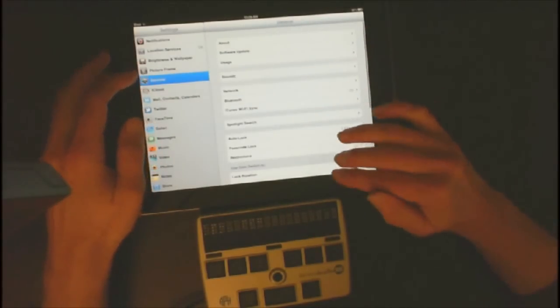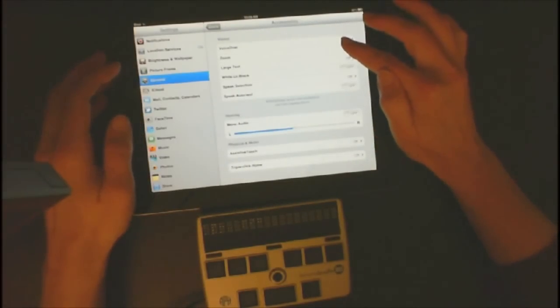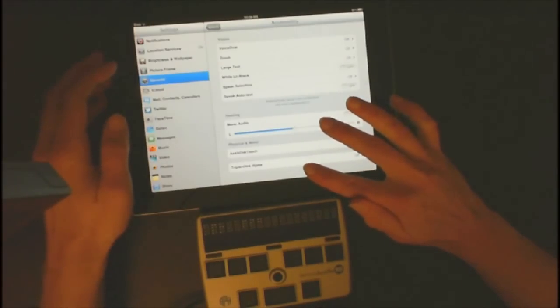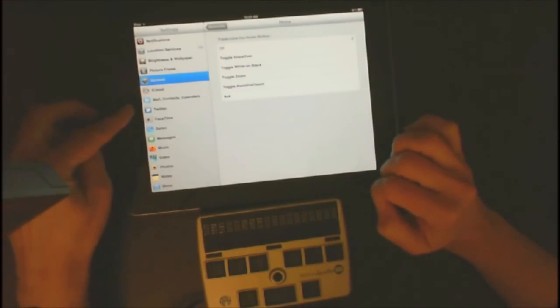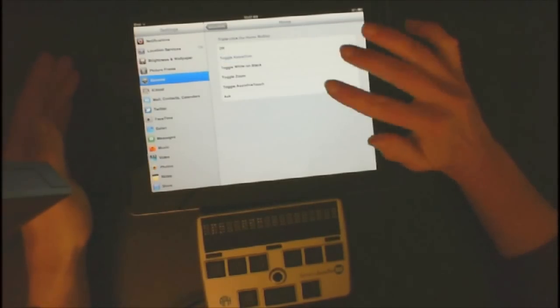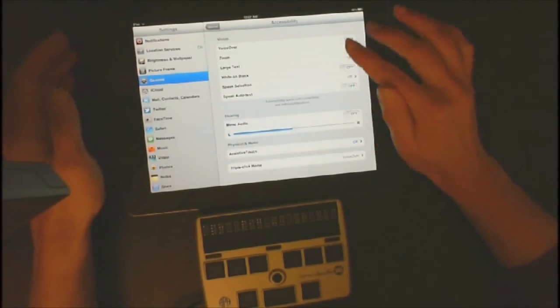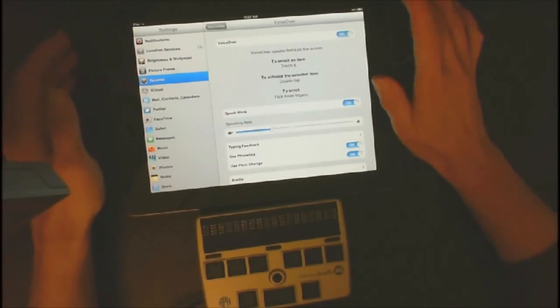I want to go ahead and go back to General and go down to Accessibility. I'm going to open Accessibility. Before I turn on VoiceOver, I'm going to go all the way down to the bottom of the screen and turn on Triple Click Home. Triple Click Home allows you to hit your Home button three times and toggle VoiceOver on, or hit it three times and toggle VoiceOver off. I'm going to go ahead and go back to Accessibility, and now I'm going to turn on VoiceOver, which is at the top of the screen.